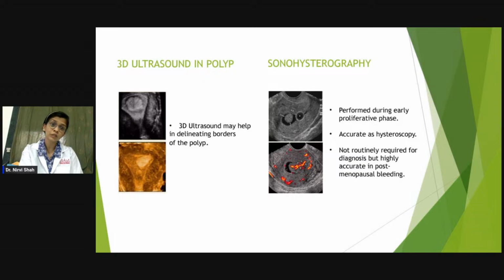Of course, 3D ultrasound also helps in delineating the border of the polyp. It also helps to plan surgery, in fact, whether surgery is indicated or not, especially in infertility patients, because that is the site of implantation of the embryo.